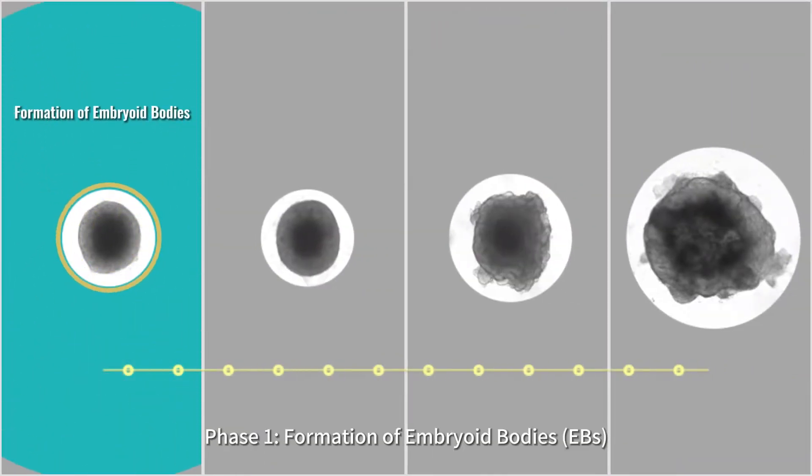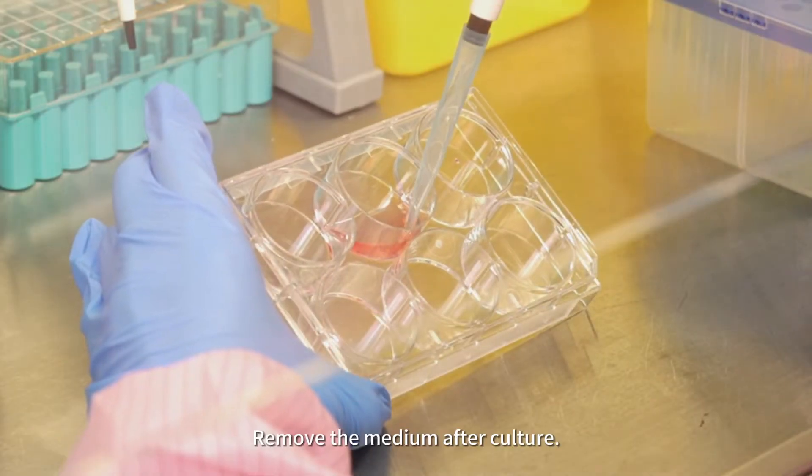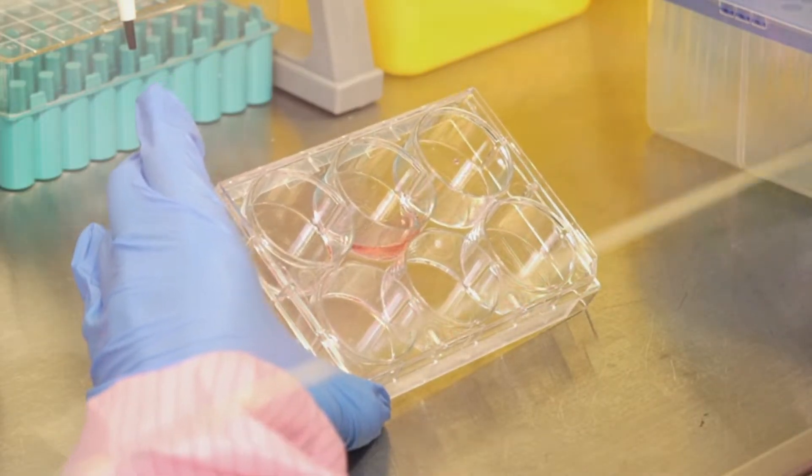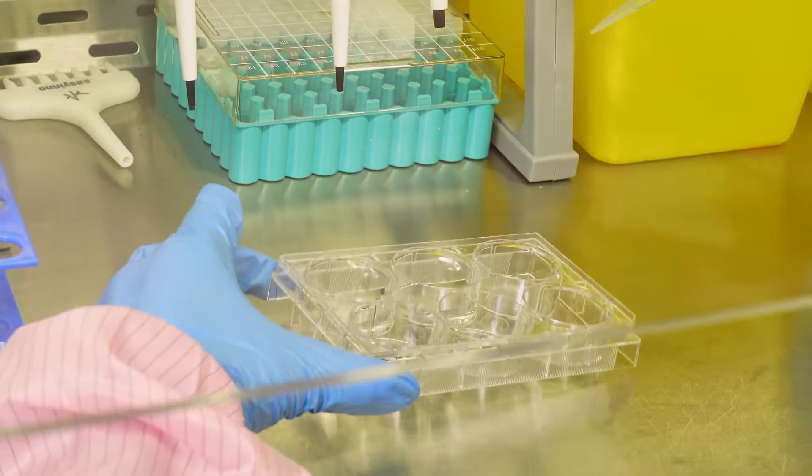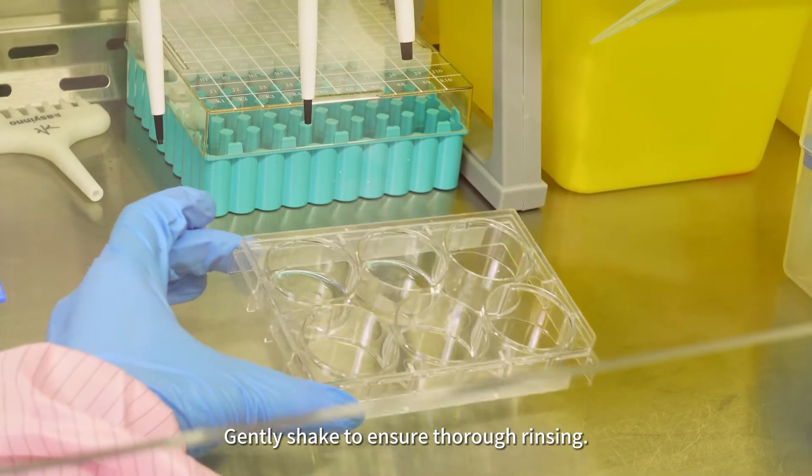Phase 1, Formation of Embryoid Bodies. Remove the medium after culture. Pre-rinse the human pluripotent stem cells with PBS. Gently shake to ensure thorough rinsing.